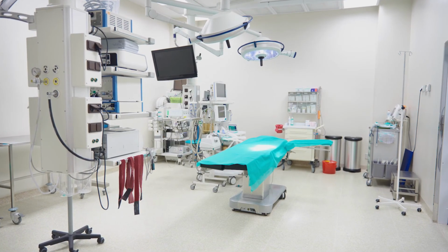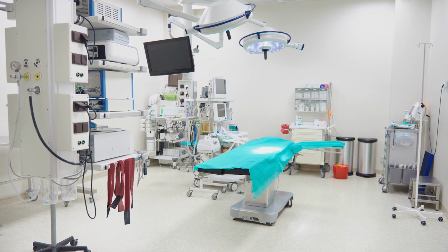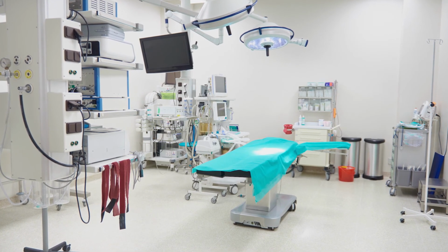Be sure to take out any live plants that may be in the room. And if the AP4 is being used in an operating room, it is suggested that a Da Vinci surgical robot not be present, because we have never tested our process with this device.